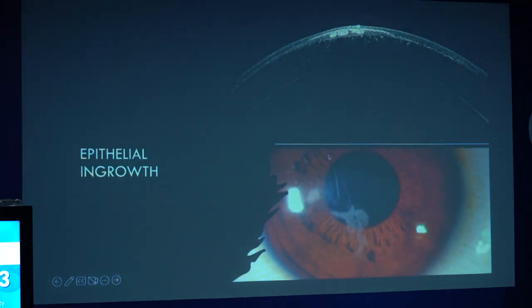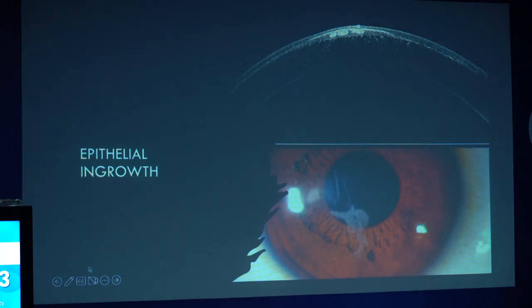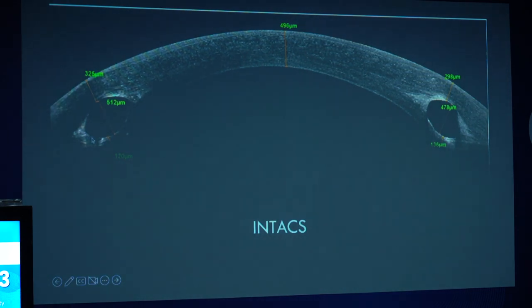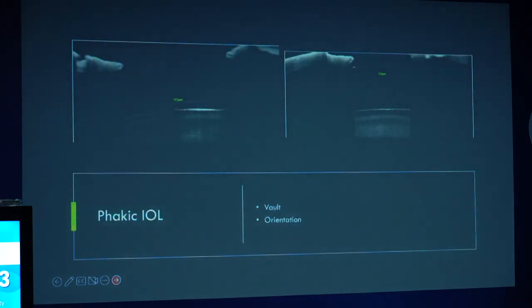This is a patient of epithelial ingrowth — you can clearly see localized nests of epithelium present below the flap. This patient ultimately underwent YAG laser to disrupt the cell nests. This is the OCT of a patient who has undergone INTACS implantation. In these conditions, OCT helps confirm that the segments are at the correct depth, in patients with impending extrusion, and can be used to sequentially monitor follow-up.